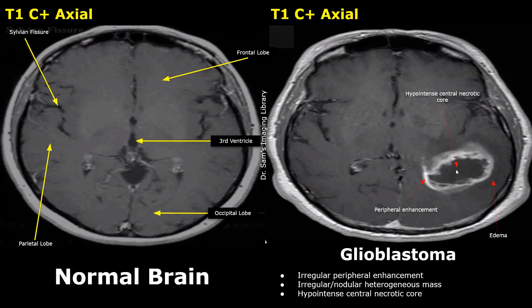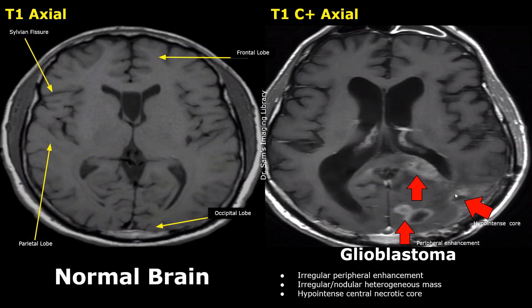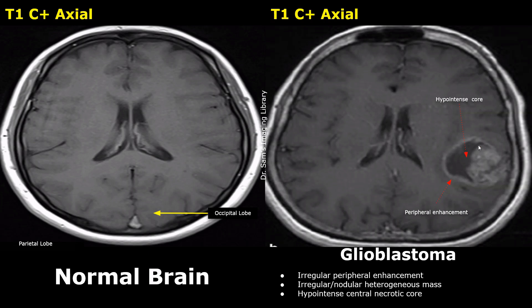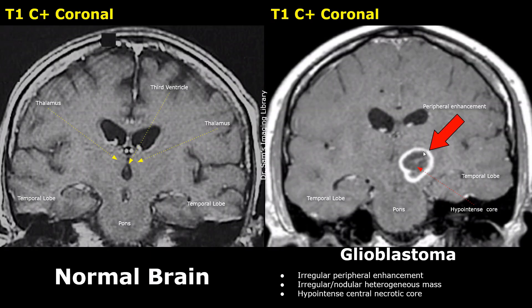In this case, there are multiple lesions in the brain, diagnosed as glioblastoma. This mass is enhanced but has a small hypo-intense core. This lesion has peripheral enhancement and a hypo-intense central core. This lesion is more heterogeneous but also has peripheral enhancement and a hypo-intense central core. This is a glioblastoma in the left parietal lobe with a large heterogeneous enhancing part, but it also has peripheral enhancement and a hypo-intense central core in a T1 contrast image. This coronal image shows a glioblastoma near the thalamus with peripheral enhancement, a hypo-intense central core, mass effect, and lateral ventricle compression.